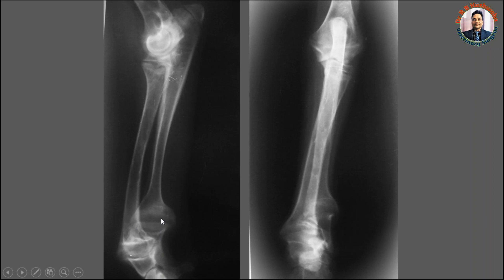In case of rickets, when there is a failure of mineralization of this growth plate, it becomes thickened. From here to here, you can see that there is an increase in the thickness of the growth plate. Similarly, here there is also an increase in the thickness of the growth plate, and you can see there is a widening of the distal metaphysis. Normally it would have been like this, but here you can see there is a widening of the metaphysis, and because of this widening, there is an enlargement of the distal metaphysis clinically as well.